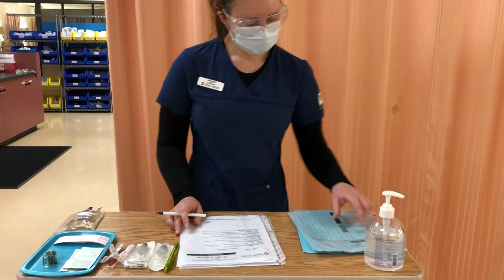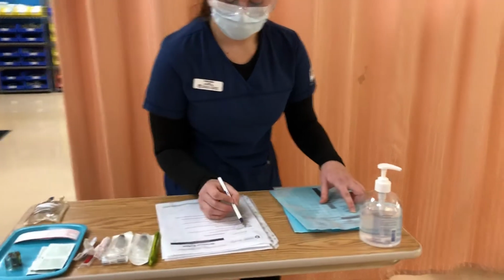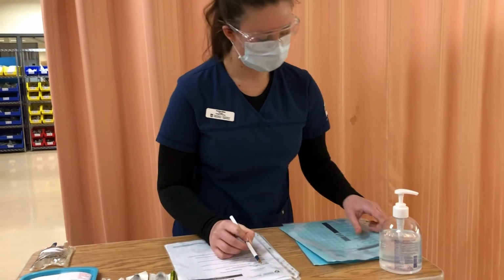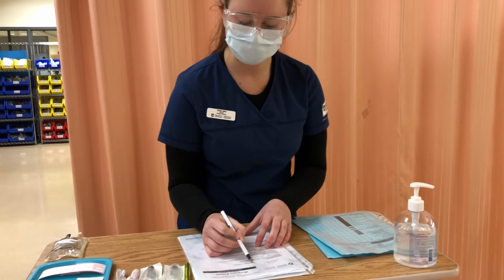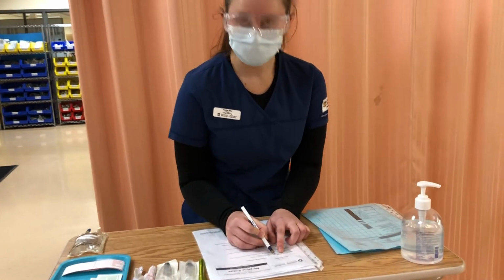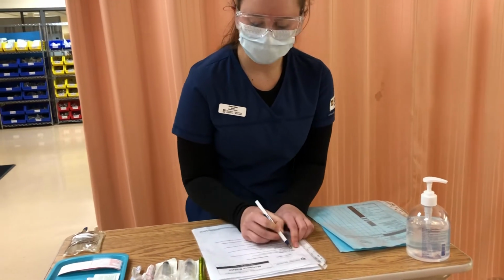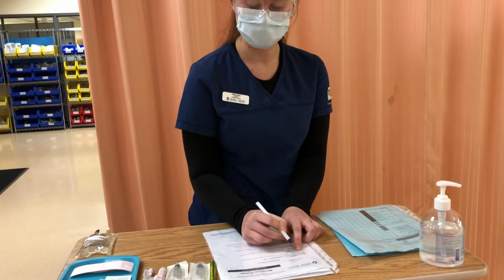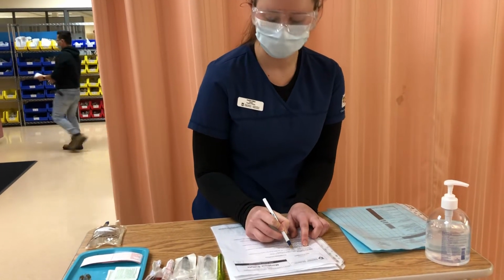So the recipe I'm looking for is for a concentration of 1 milligram per milliliter. So here I have the concentration of 1 milligram per milliliter, so I will be using this first recipe, and this is for PCA. So I will be drawing up 50 milligrams, which will be 10 milligram per milliliter, 1 milliliter ampules. I will then be diluting it with 45 milliliters of normal saline for a final volume of 50 milliliters and a final concentration of 1 milligram per milliliter.